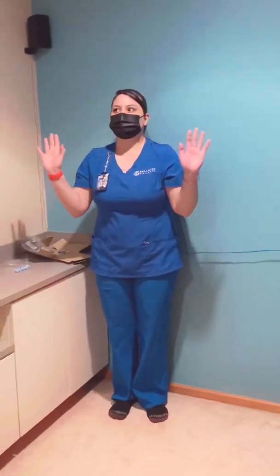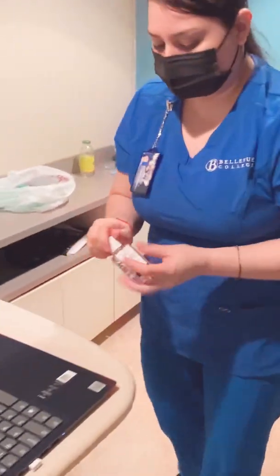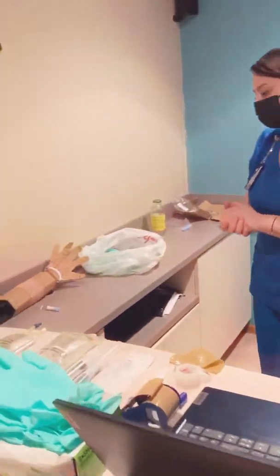Patient is on standard precautions. Knock, knock. May I come in? Come in. Provide some privacy. I'm going to wash my hands here. Hi, my name is Vanessa. I'm going to be your nurse today. How are you doing today?